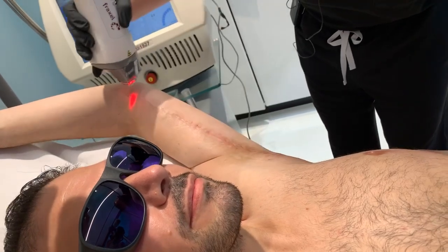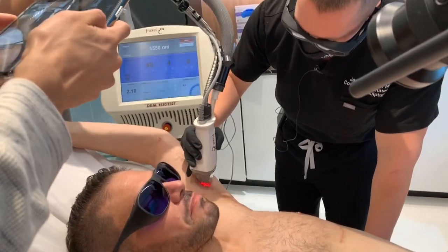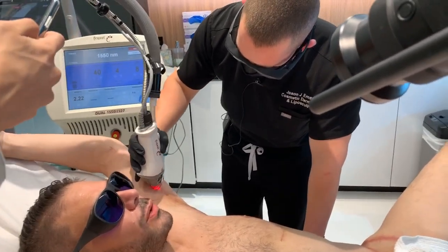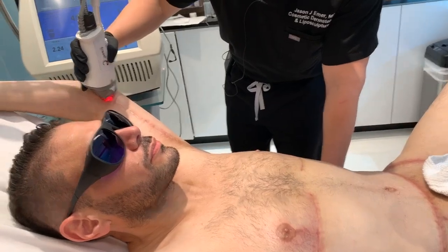How does it feel? Does it hurt or no? It's not the best thing in the world, but honestly, it's like a light treatment of laser hair removal. Some people it's worse than others.